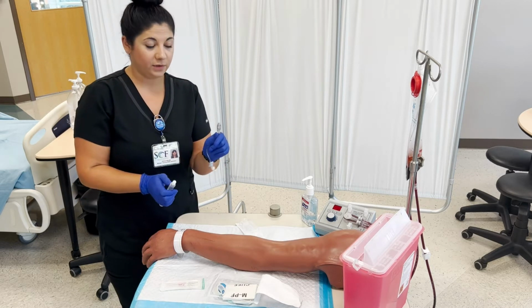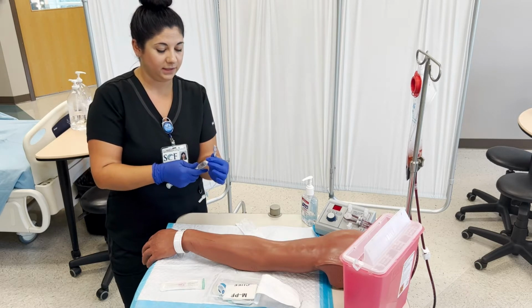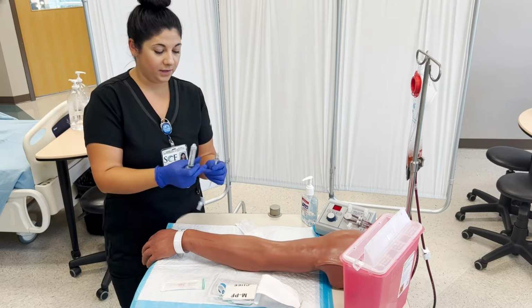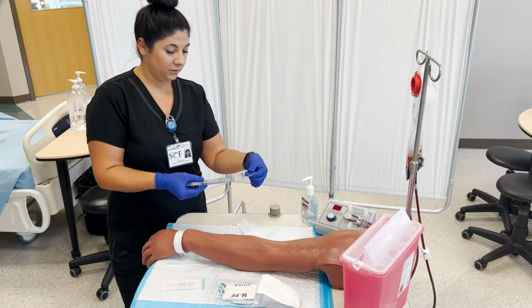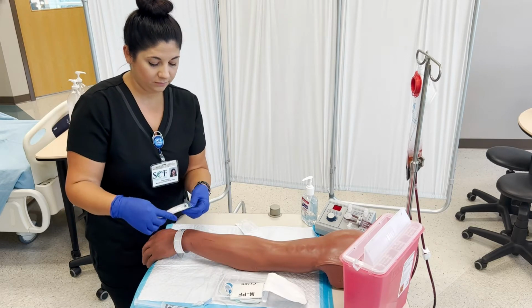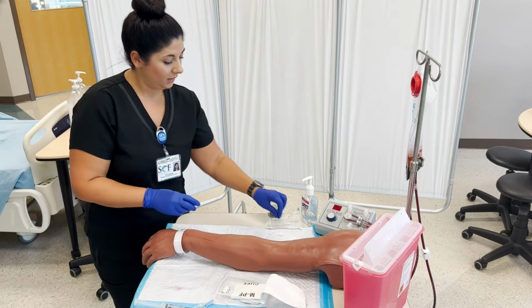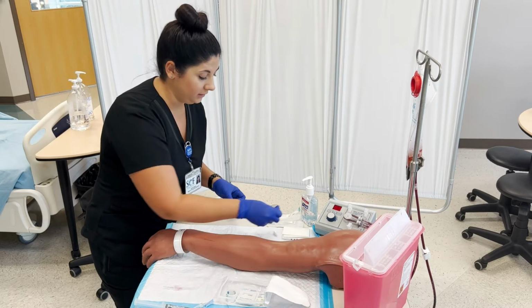I'll get my flush ready. So I've pulled this out of a sterile container and I'm going to not touch that end so it remains sterile. Getting all the air out there. Just flush that through so it's ready for you. And then we'll put it to the side. Everything I don't need, I'm just going to put over to the side here.